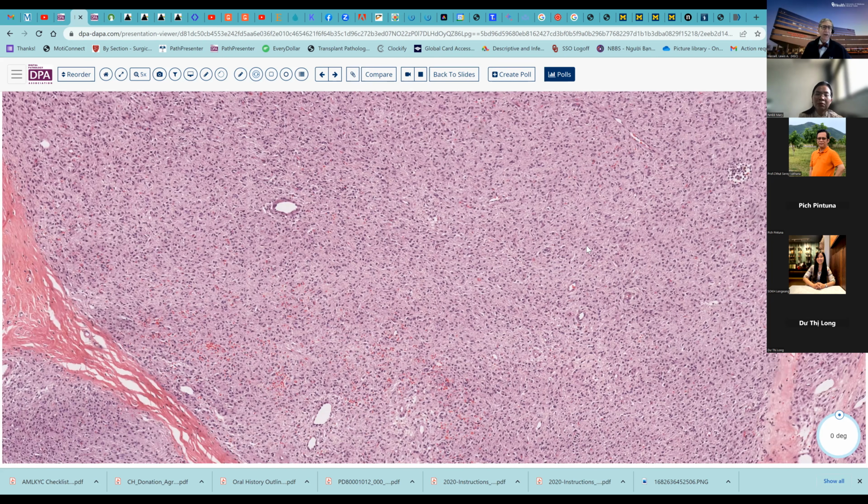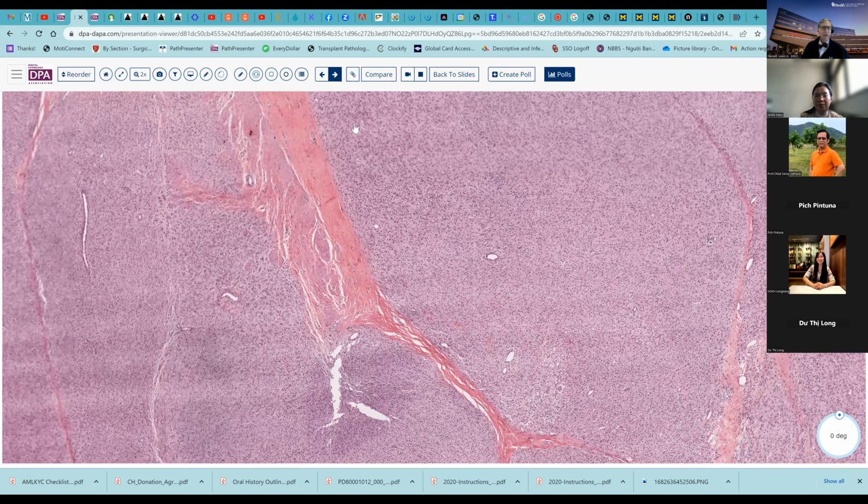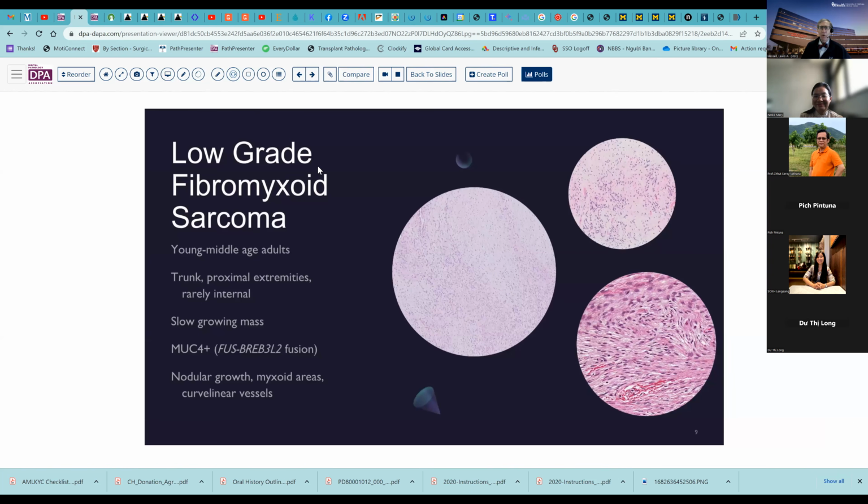be confused with one another if you're not aware of the issue that we're dealing with, or the location, or the patient age, and so forth. So diagnosis, I'm sure you're all very familiar with that. CD117, DOG1, those are the stains that jump out at us as being very conclusive. And I haven't put very many examples in here today because I know you've all seen these and you'll see them throughout your career.